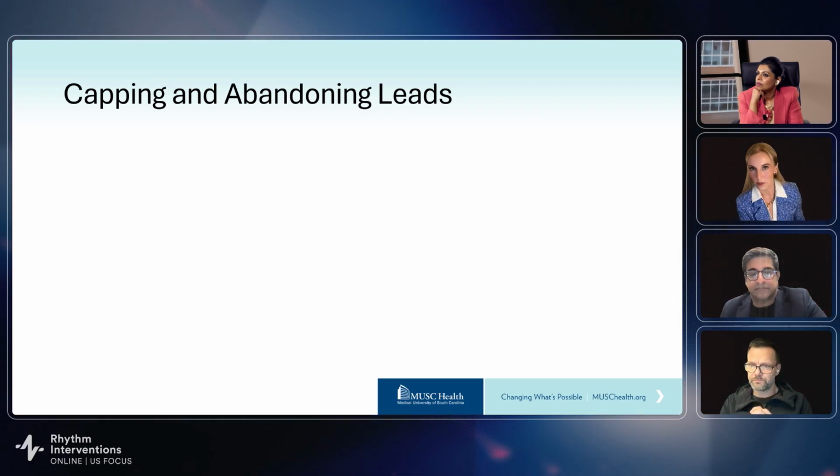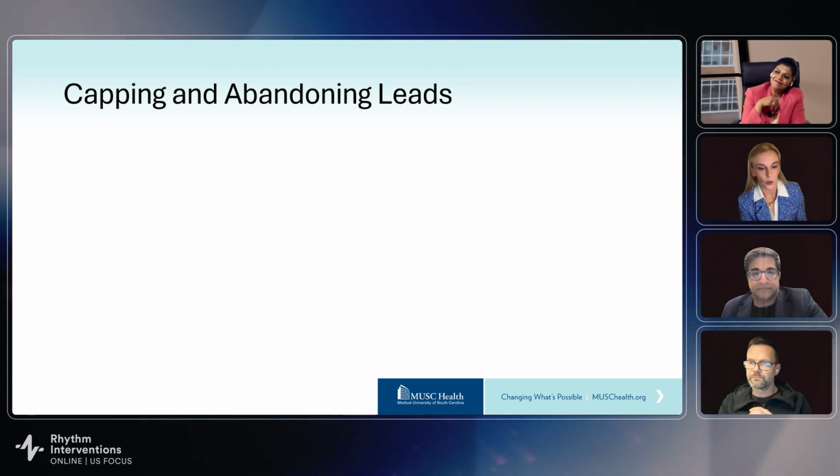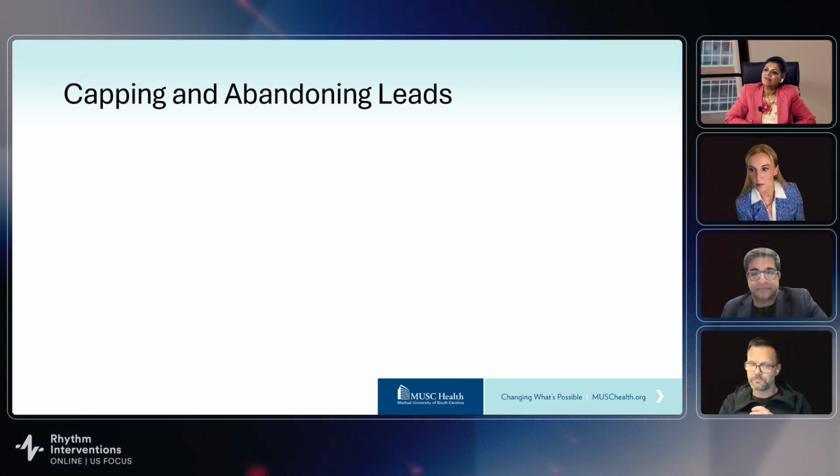I always have some sort of echo imaging, be it ICE or TE, or sometimes both. My anesthesia colleagues love their TEs, so they're relying on that. They're always in the room, even when we're in the EP lab, and start to check, and we can get a pretty good idea what's going on.